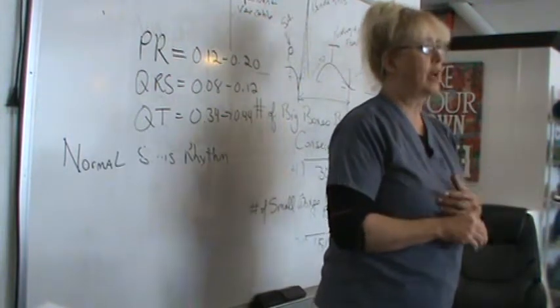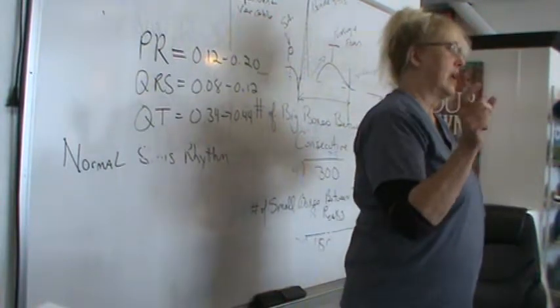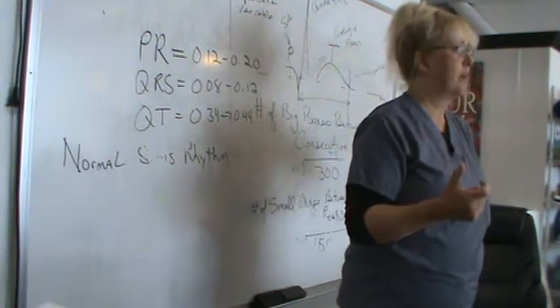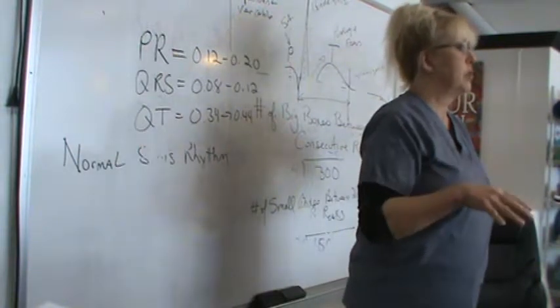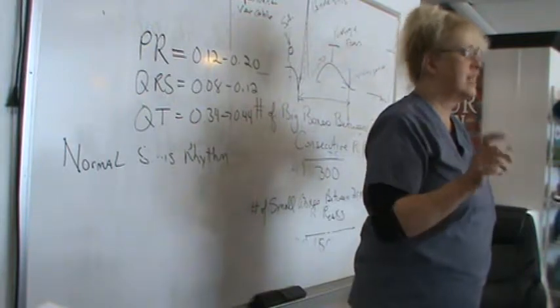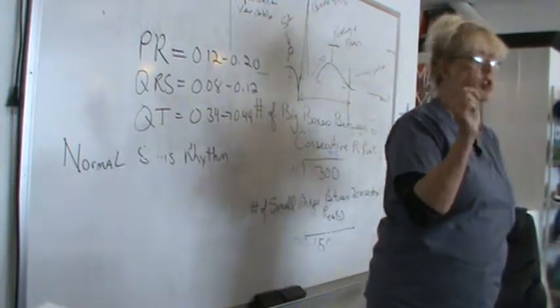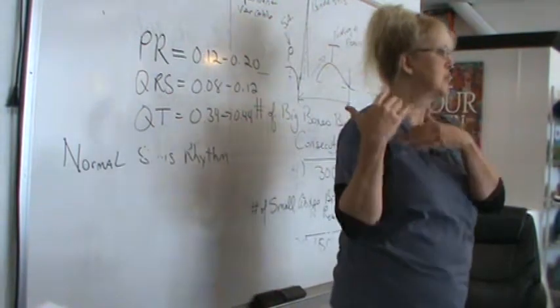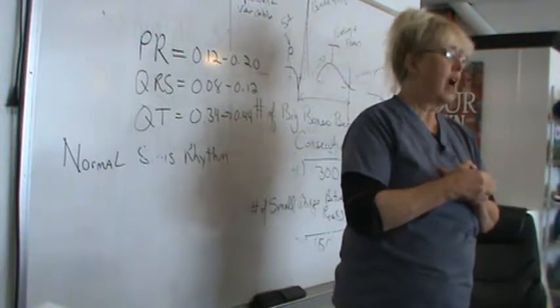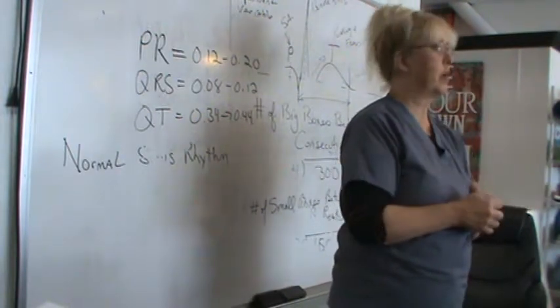I want you to pay close attention to the fact that even though it gives you the heart rate, you still have to calculate the heart rate. That doesn't take away from your job. What I've showed you is the best way to accurately calculate distances. Obviously we were off maybe a point or two, and that's acceptable because we were all within the norm. But regardless, if you see something wrong, you have to address that situation.